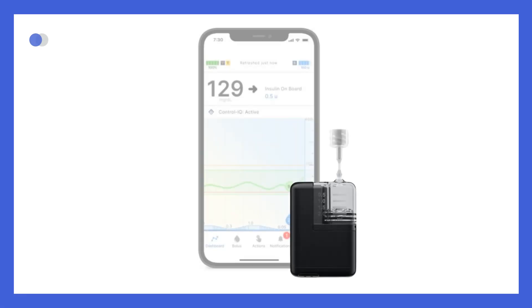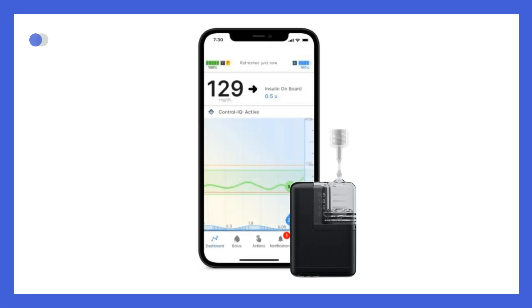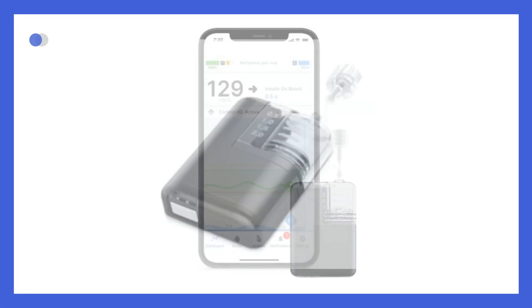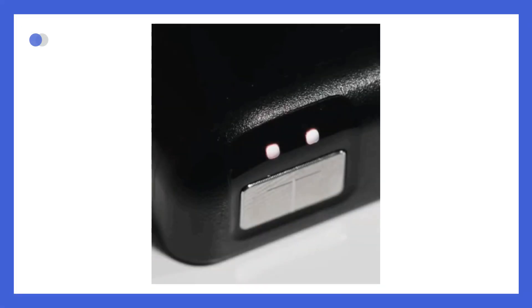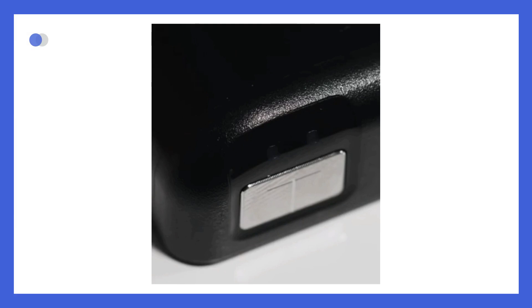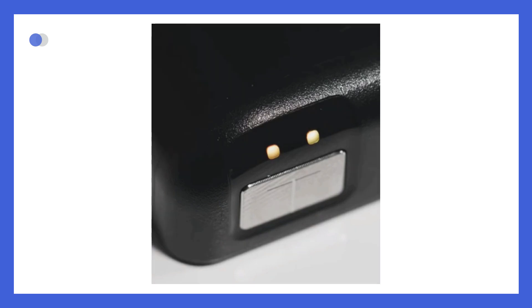The pump has no screen and is controlled by the Tandem Mobi mobile app. It has one pump button on the bottom. This button is used to turn the pump on or off, deliver a quick bolus, snooze alerts and alarms, and activate the pump's status lights. Above the pump button, there are two status lights that light up in different colors and patterns to let you know what the pump is doing even if you don't have your smartphone with you. To view the lights, you need to press and release the pump button.